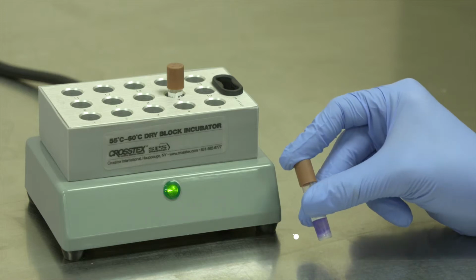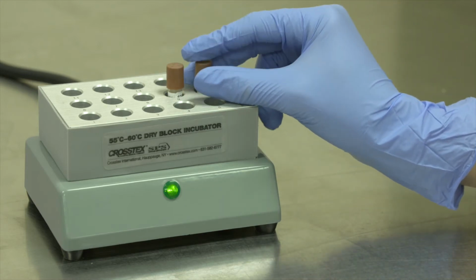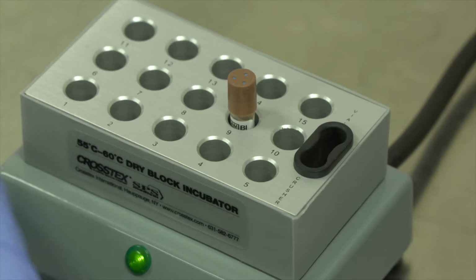In addition to your processed SCBIs, an unprocessed control indicator will also be needed. Simply activate or crush an SCBI which has not been processed or sterilized to serve as the positive control. It's imperative that the unprocessed control has the same lot number as the processed SCBI. Use one test indicator and one control indicator for every sterilizer in your office.